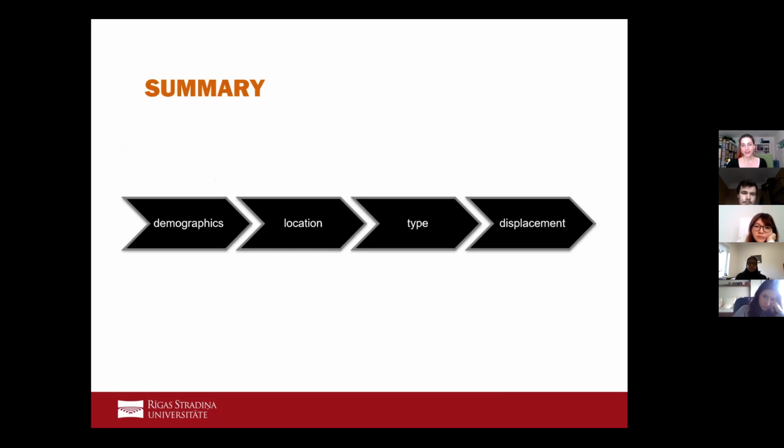So let's summarize this whole chunk of information we have just discussed. When it comes to the diagnosis of fractures with radiographs or imaging, we'll first look at the demographics. Do we have the right patient? Do we have the right body site? Then we're going to look at the location of the fracture. Which bone is it? What structures are affected?